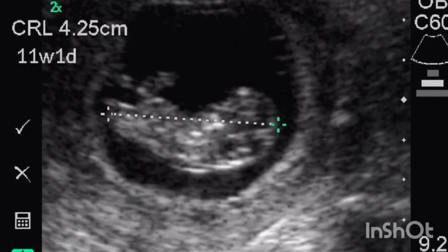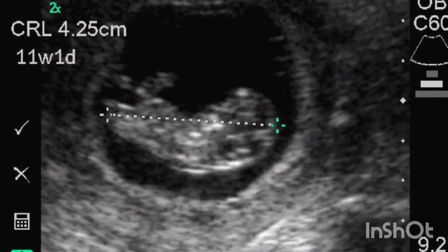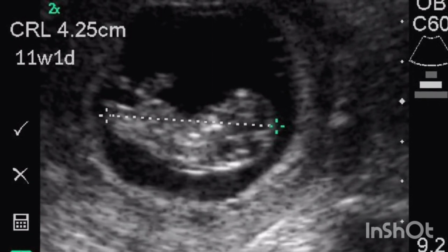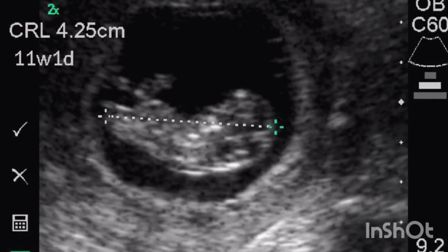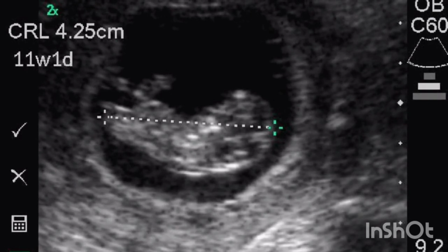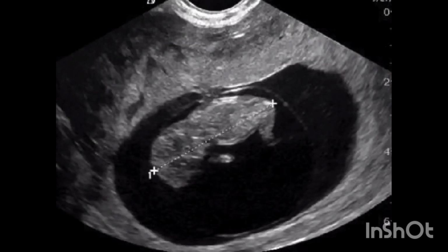The embryo becomes a fetus after 10 gestational weeks, that is, 71 completed days based on the LMP. The accuracy of the crown rump length in dating the pregnancy depends on good correlation between this measurement and fetal age in a period when growth is rapid and minimally influenced by fetal pathology. Crown rump length is thus very useful in calculating gestational age. With this gestational age, doctors can estimate your potential due date.